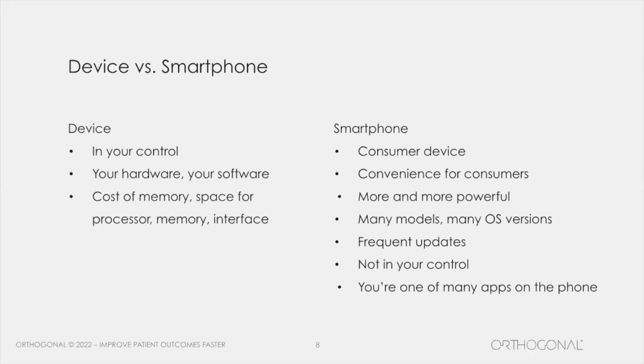You have to think about both the models themselves and the different operating system versions that may be on those models. There are hundreds that are generally in use, but it's actually the number of device profiles, those combinations, in the US alone that are in the market that is over 12,000. So different animal in this case.